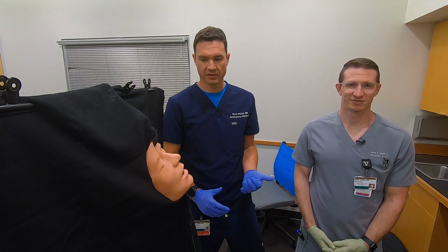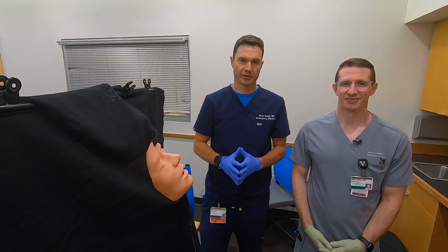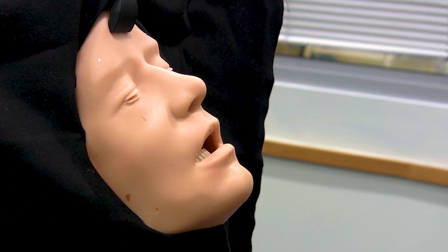All right, I'm joined by Dr. Lesnick today. We're going to use our task trainer here to go over peritonsillar abscess drainage.